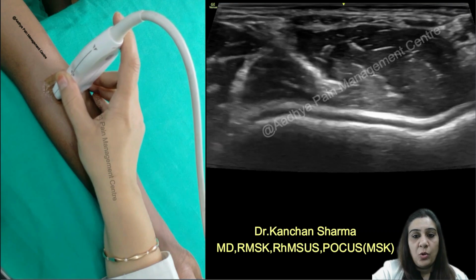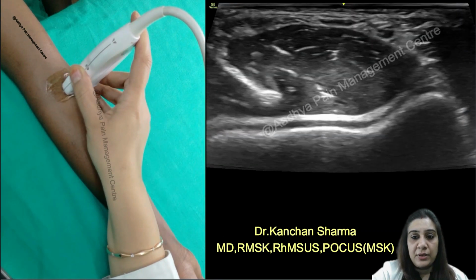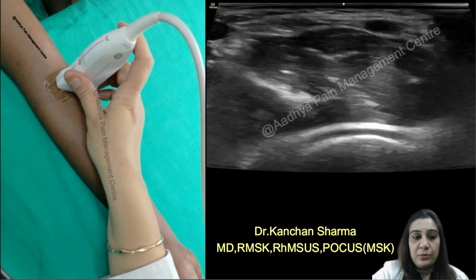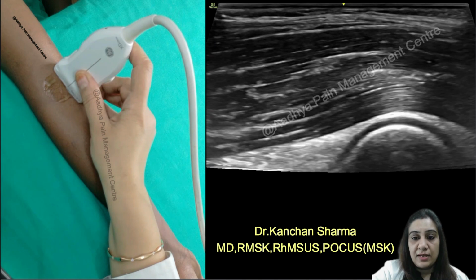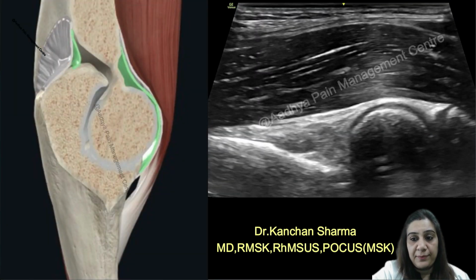So this is our home page view. So I'm going to slide my probe medially and I'm going to keep the trochlea at the center of the screen. Now I'll be rotating my probe to 90 degrees. And at the same time, I need to increase the depth also. So once I have increased the depth, I will be able to see something like this.